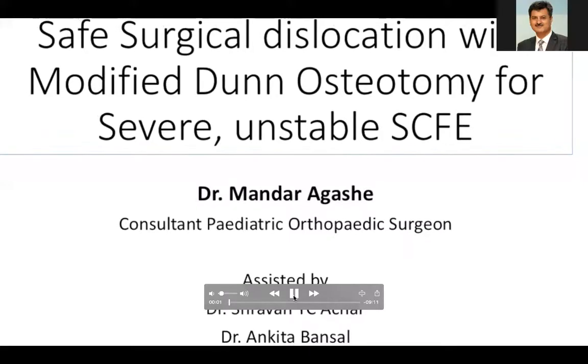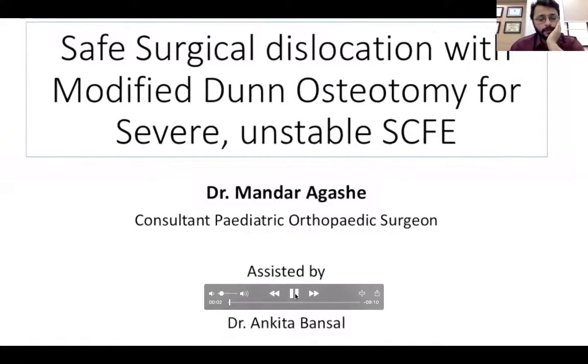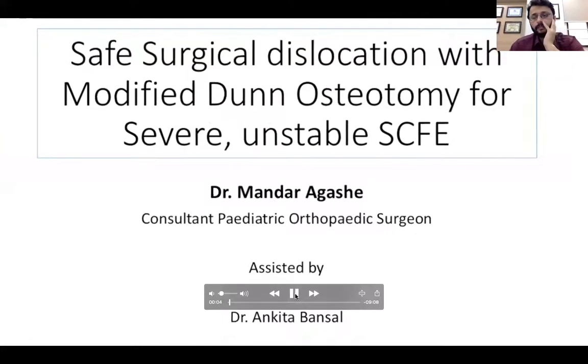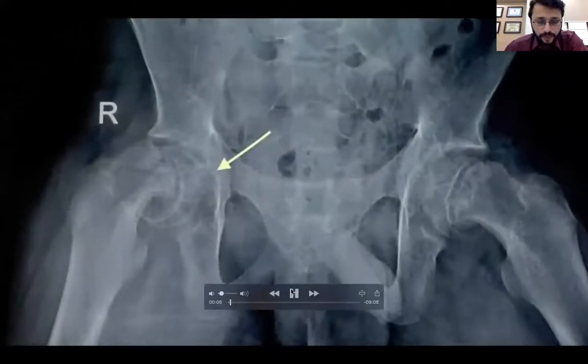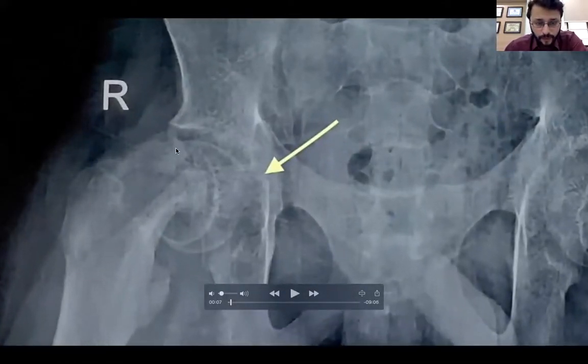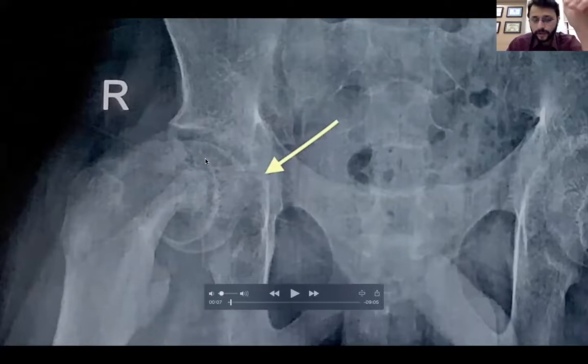So this is a video where I was helped by Dr. Shravan and Ankita. This was a severe slip, as you can see. You can see this metaphyseal eburnation. This is one sign which I always look for. This is metaphyseal smoothening, which is not seen in an acute Delbet fracture. So this is where you differentiate an acute Delbet fracture from a slip, and you have a lot of callus posteromedially, right?